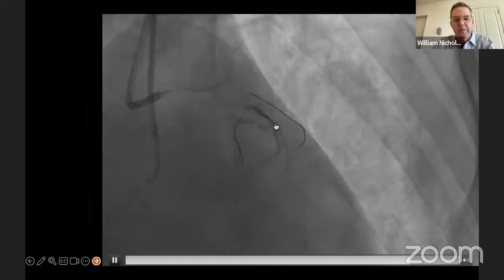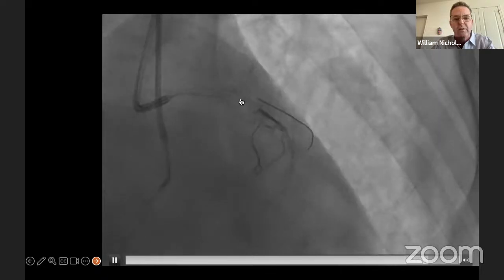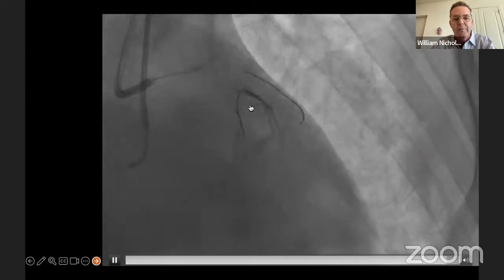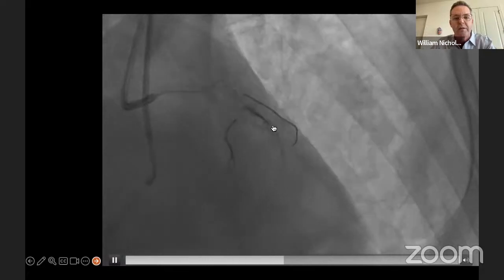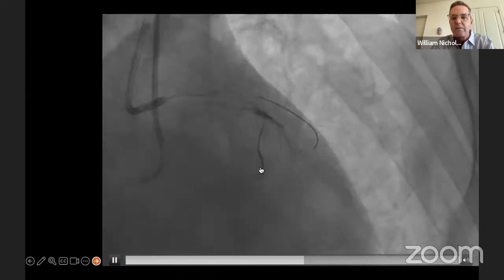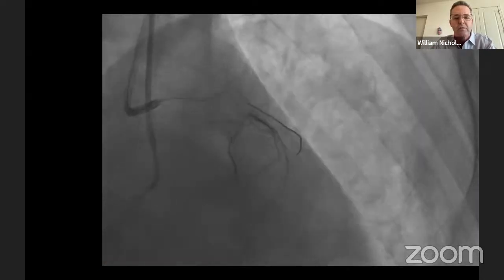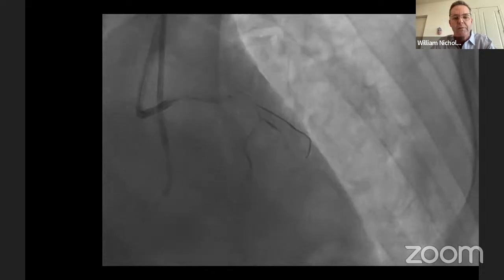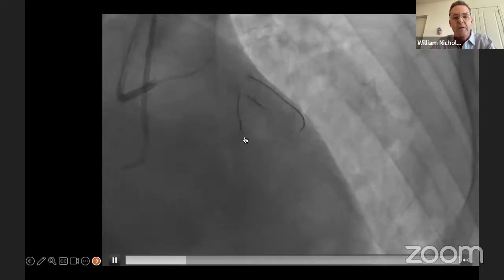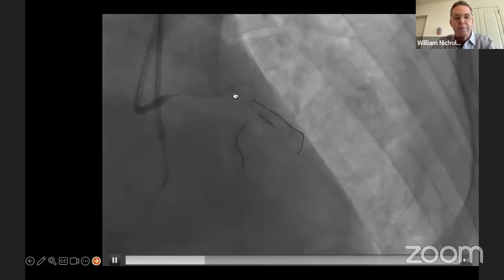This is our microcatheter sitting on the distal cap with a tip injection to try to understand, is there, we hope, maybe a confluence? You can see pretty clearly the contrast just rebounds right off the distal cap and heads down the LAD. So there's no upstream connection. It's kind of the worst case scenario that you're coming into, saying now we've got a true CTO segment with a true large diagonal coming off of it in a bifurcation fashion, with probably 5 to 10 millimeters at a minimum of actual occluded segment in the LAD.